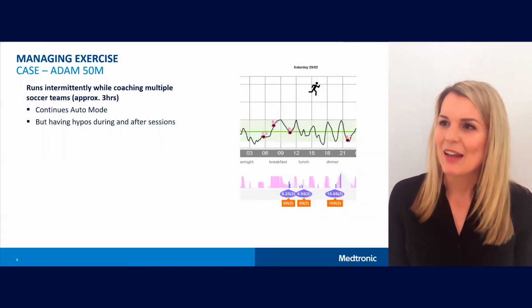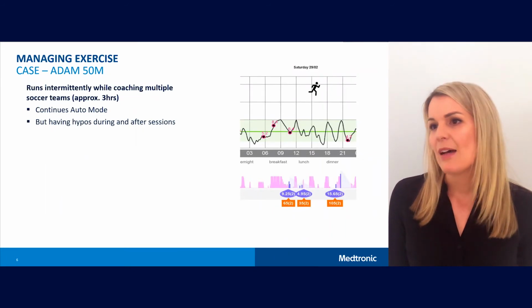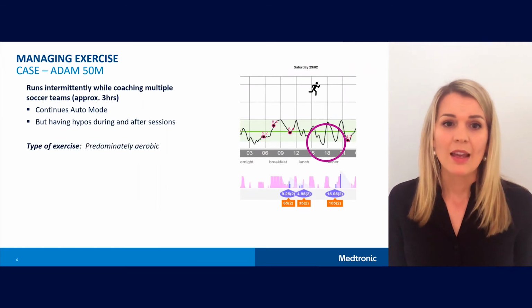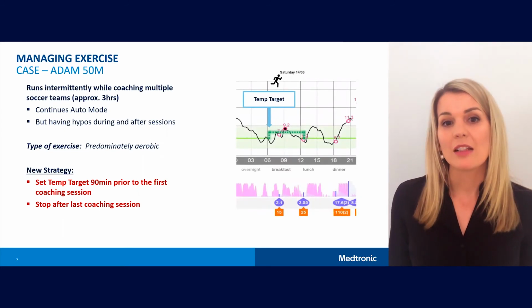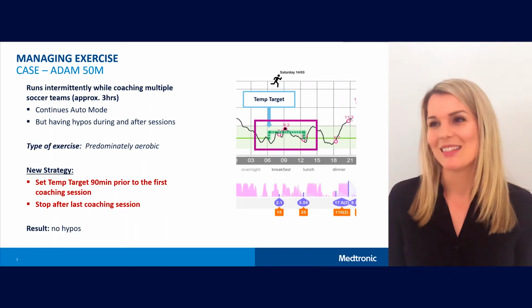Here we have Adam, a 50-year-old male who runs intermittently while coaching soccer. He normally continues in auto mode, but found he's having hypos during and after sessions. We recommend that he set a temp target 90 minutes prior to the first coaching session and stop after the last coaching session. He's found that this has stabilised his blood glucose levels.